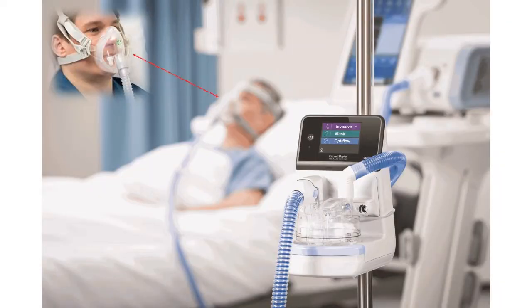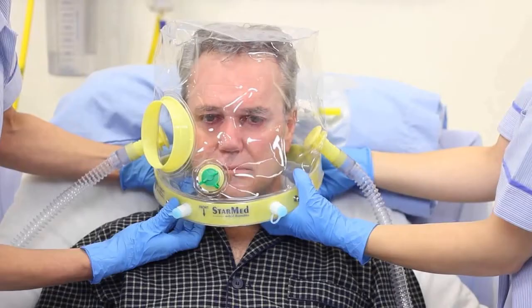An alternative method of ventilation can often be used either to delay or to altogether avoid invasive ventilation, and that is called non-invasive ventilation. Non-invasive ventilation requires use of a non-invasive mask or a NIV hood to deliver oxygen and air mixture under pressure to the patient's lungs.